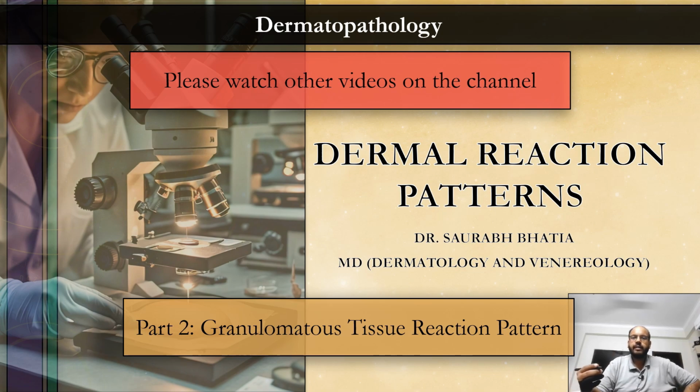Now remember that even if we have prototypical reactions or prototypical disorders, for example, in the sarcoidal granulomatous reaction pattern, we do have sarcoidosis, which is a prototype of that disorder, you can have different types of granulomas in a single slide. But you just have to look at the major pattern of granulomas that are there in the dermis.